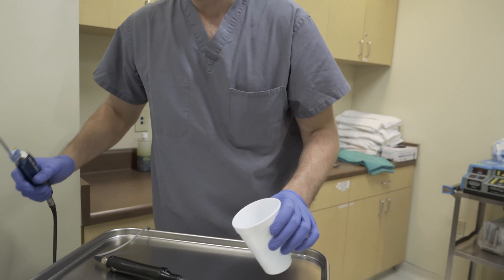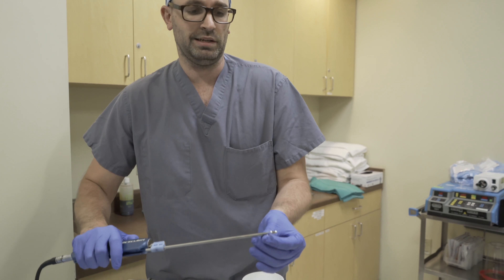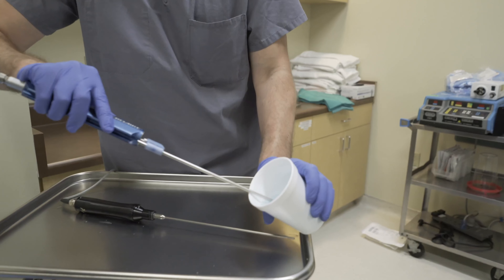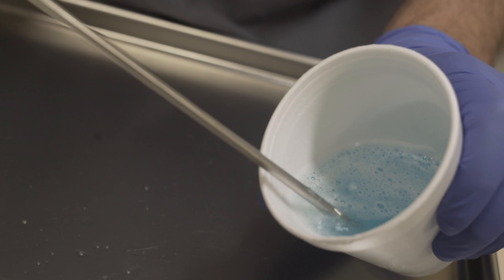Now that doesn't break everything up, so we come through one more time with this exploded cannula, also known as a basket cannula. That just helps to break things up one more time. We put this in the water and you can see it helps break that up and encourages any last stubborn fat that didn't want to break loose to get loose.